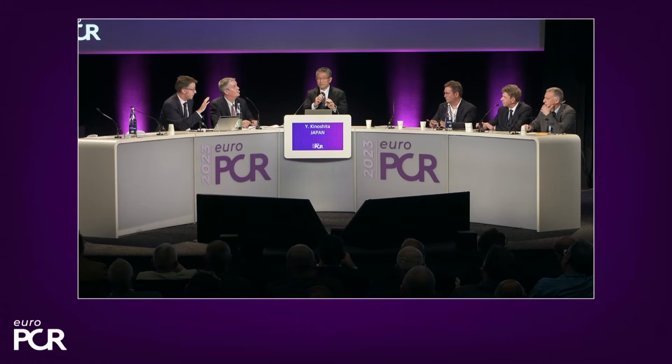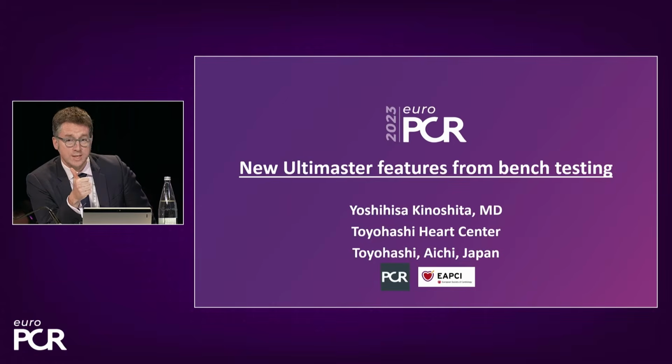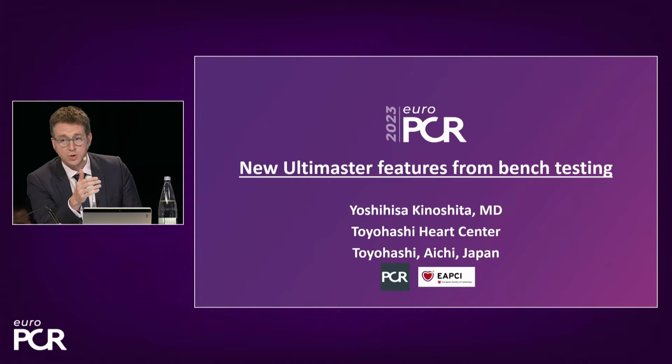Yeah. Can you present the features? Just before that, let me just bring in some of the interaction from the audience, because I think before we dive into stenting this vessel, we do have to broach surgery versus PCI, and we have here some challenging questions. Should we use the CT in order to promote towards bypass surgery? Well, that has been looked at in the Syntax 3 study and shown in just over 200 patients, the utility of CT to actually guide decision-making towards bypass surgery. And then another question about whether we should be scoring this patient by Syntax. I'm sorry, I didn't have time to show you those slides.